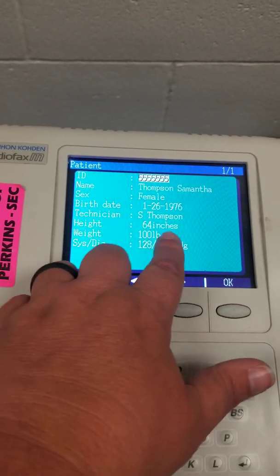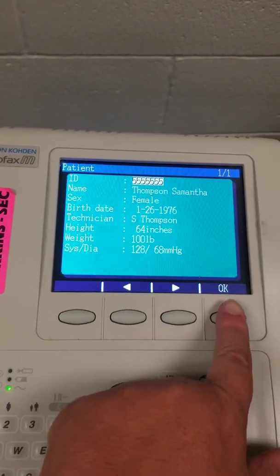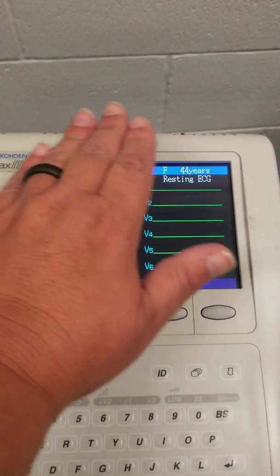If your patient wishes to not tell you their weight, just list them at 100 pounds. Once you're done, you're going to click the OK button, and it will bring you back to this.